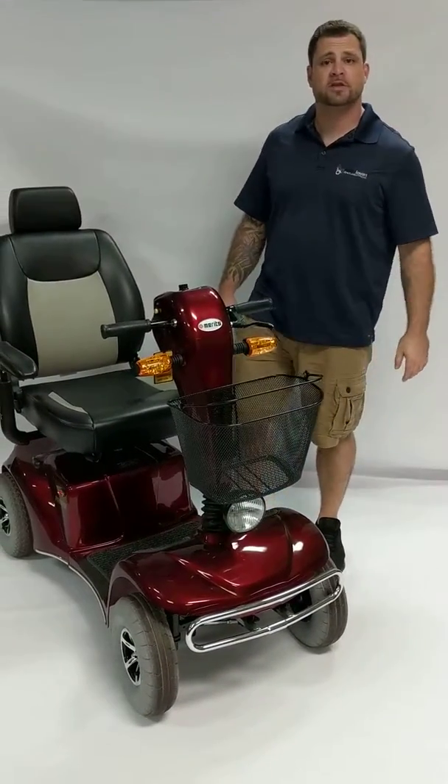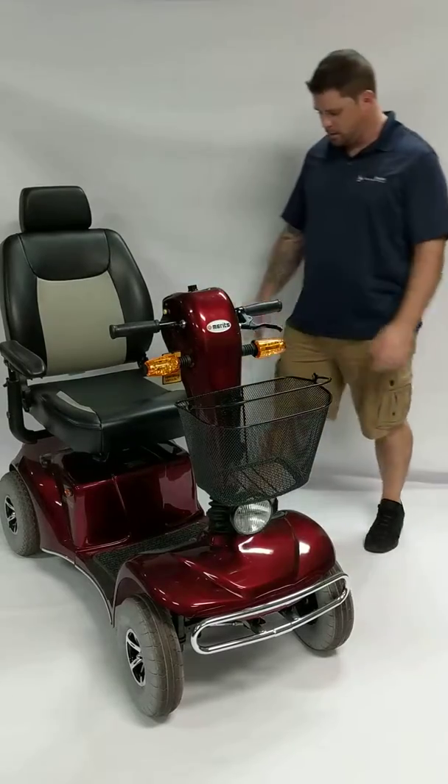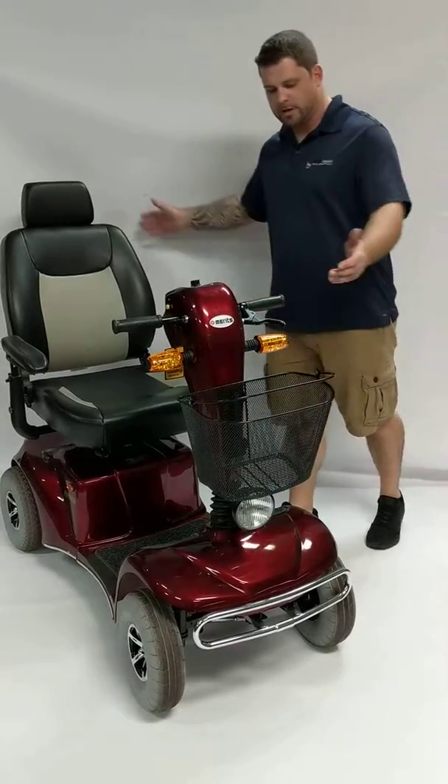Hey guys, this is Drew with Mobility Scooters Direct showing you the Pioneer 10 four-wheel mobility scooter.